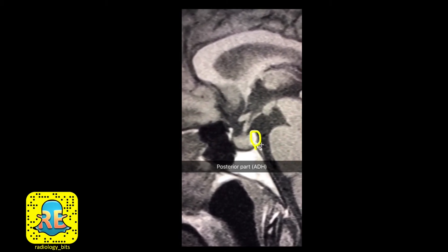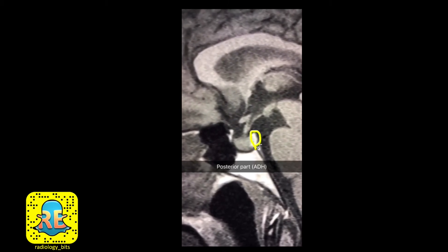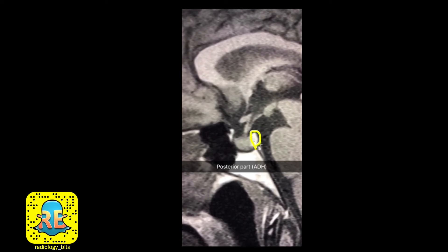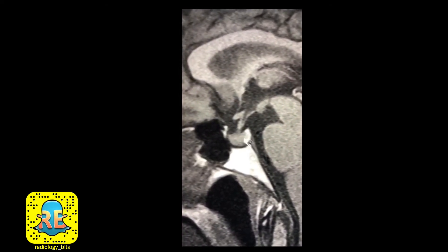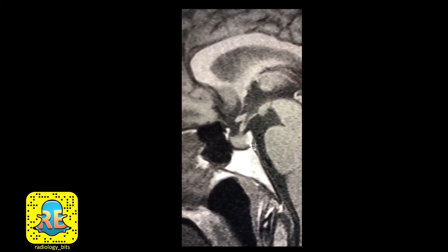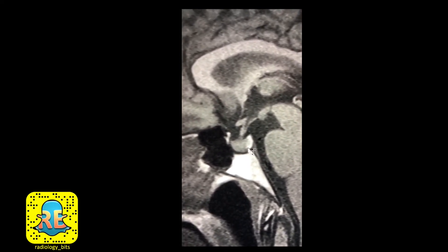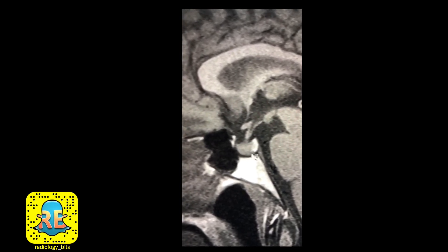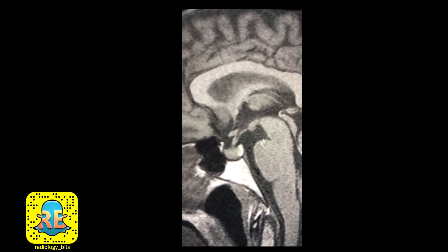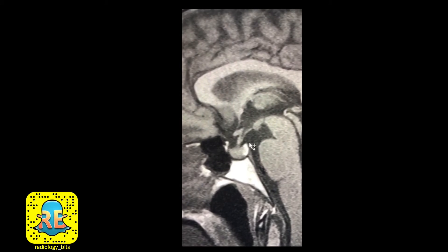The posterior pituitary is bright on T1 because it contains the vasopressin hormone, also known as antidiuretic hormone (ADH) — a hormone that is spontaneously white on T1. You can see the posterior pituitary brightness on T1 in most adult patients, so checking for it should be part of the radiology resident's routine when assessing a normal pituitary gland.